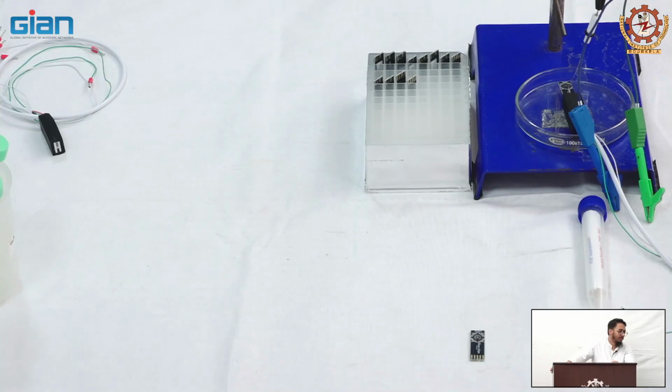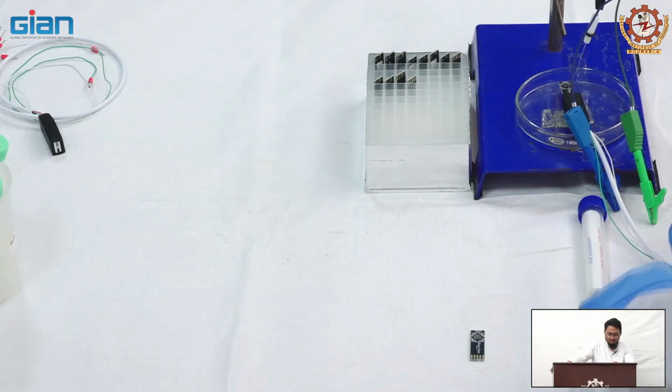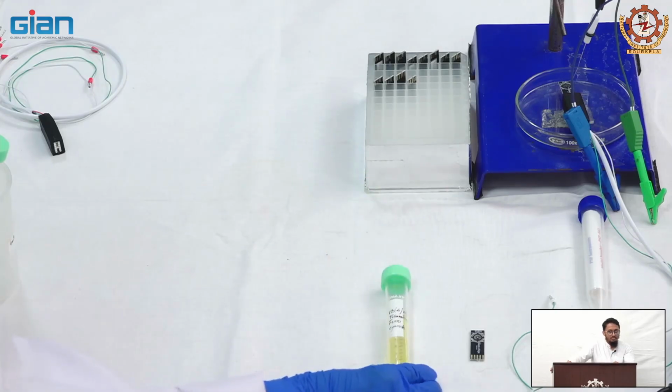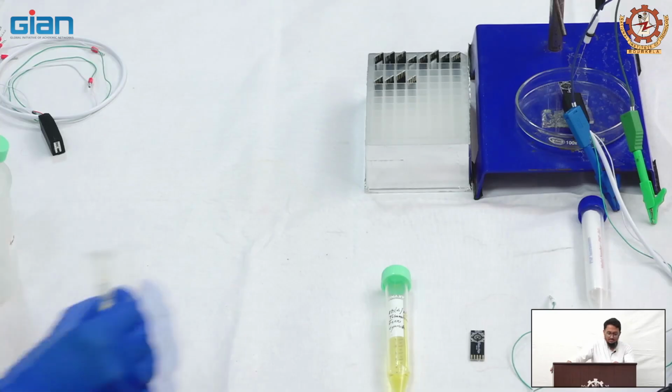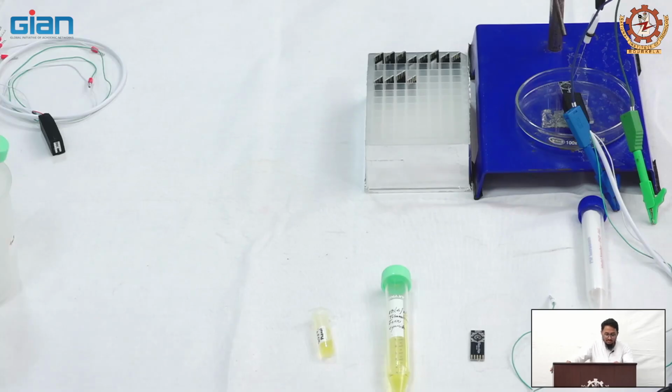Moving on, we also have a potentiostat with us which will help us do different types of characterization and functionalization methods. The chemicals that are required for today are as follows: potassium ferricyanide solution, and glucose oxidase and phenol dissolved in PBS 100 millimolar. Before today's session we have mixed 6.6 milligrams of glucose oxidase in 1.5 ml of PBS and 0.705 milligram of phenol in 1.5 ml of PBS.